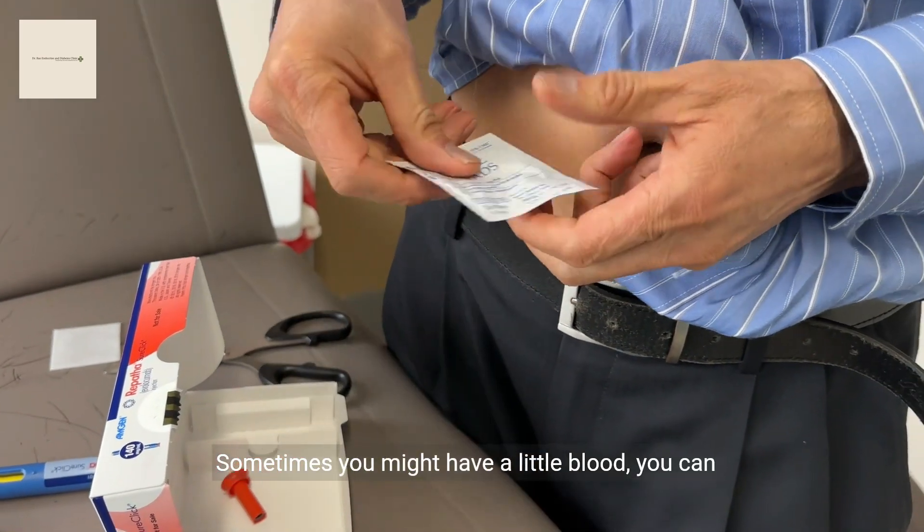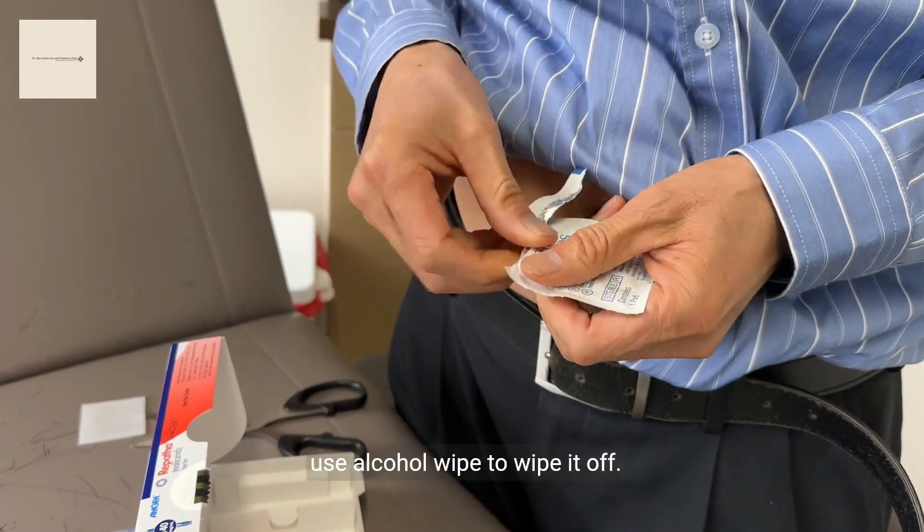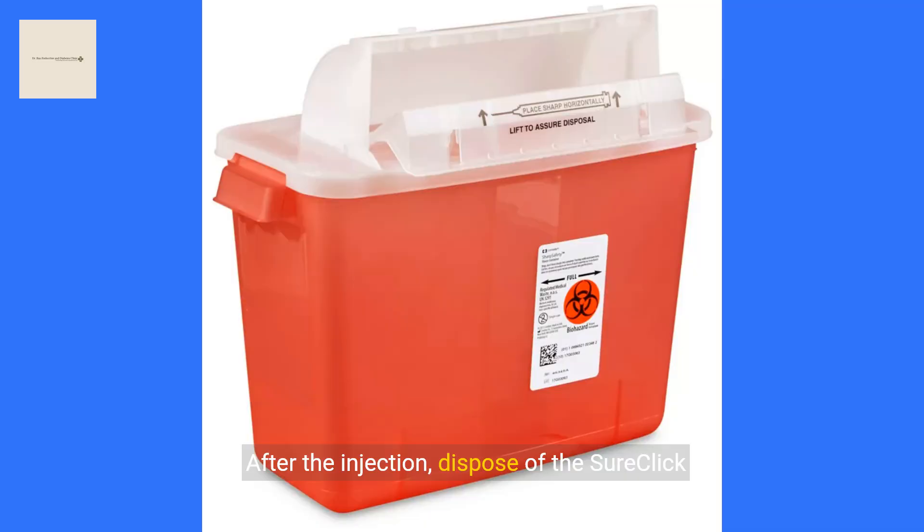Sometimes you might have a little blood — you can use the alcohol wipe to wipe it off. After the injection, dispose of the SureClick auto-injector according to local regulations. Never reuse an injector.